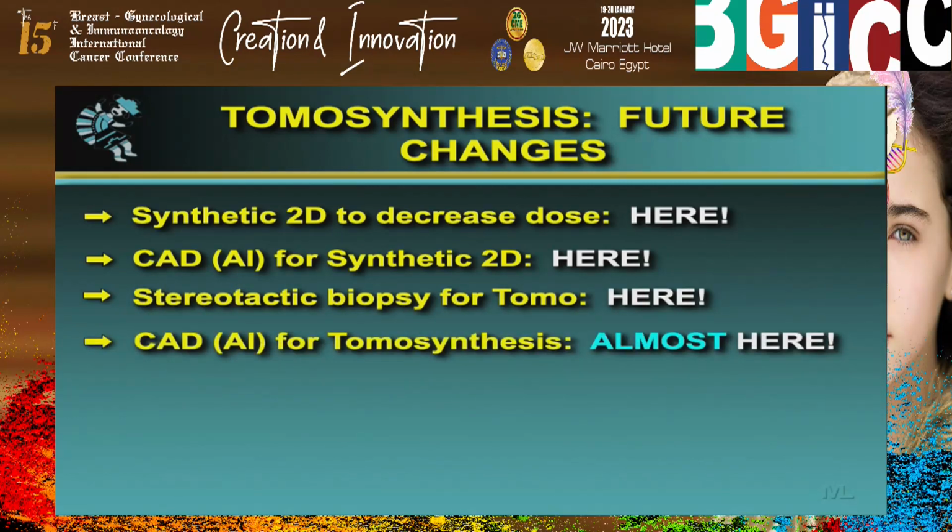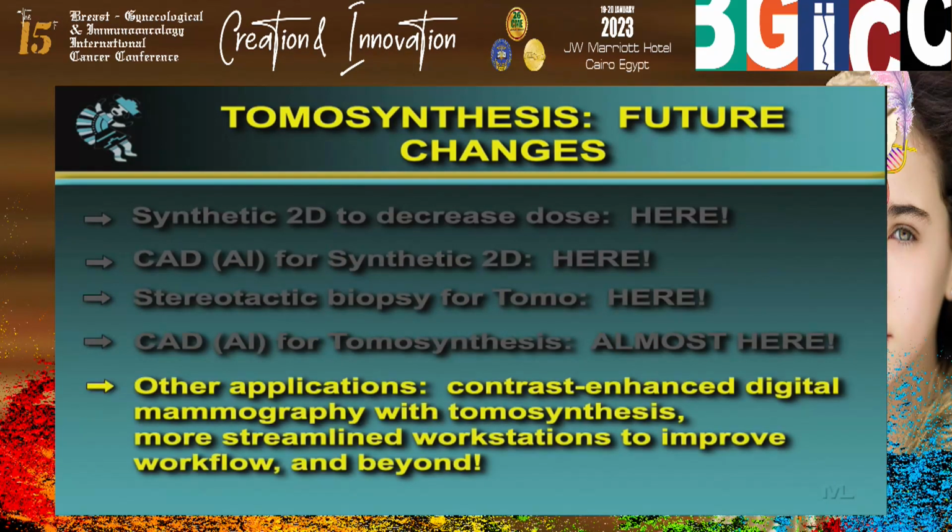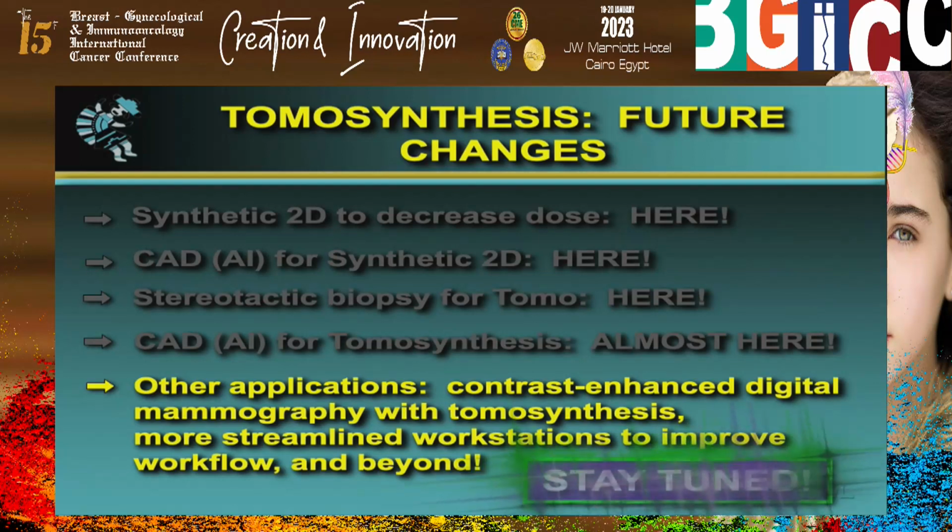This also is almost here. AI has done a tremendous job in helping us with tomosynthesis. It's going to make our lives much more pleasant in the future. And you're going to hear more about AI from Dr. Mansour very shortly as well. So going forward, we can expect other applications, that is, contrast-enhanced digital mammography with tomosynthesis is being developed, and many more changes in terms of the workstations to improve our workflow and beyond. We can expect many more changes in the future, I'm happy to say, so please stay tuned for this very exciting advance we see in tomosynthesis.